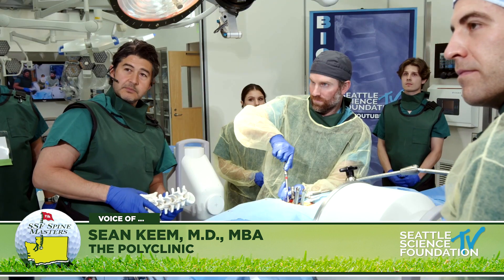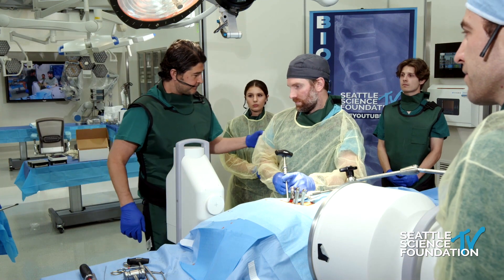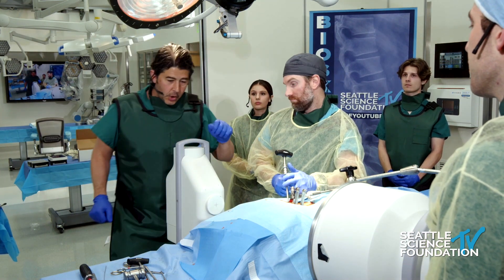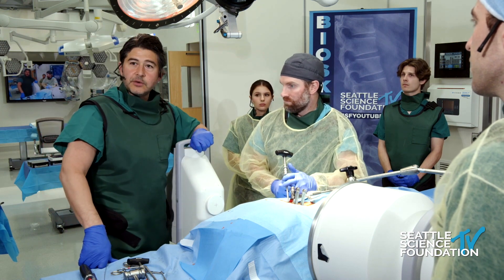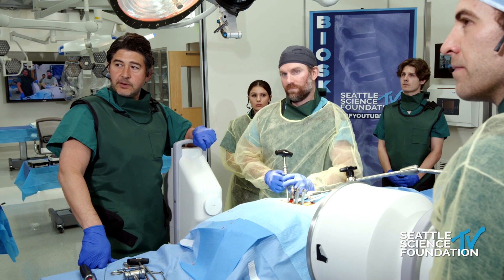Is that a Stryker system that you're using? Yes, this is the Stryker system. Do you have to put screws first before you put in the interbody? No, I think you can do it either way. I actually used to do my interbody first before I put in my screws.